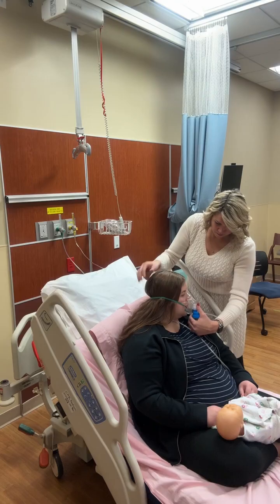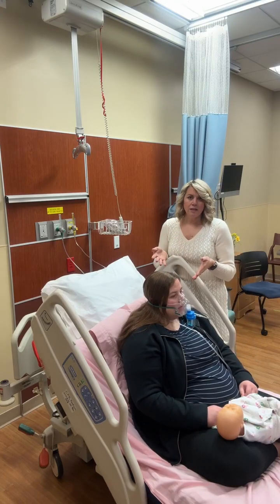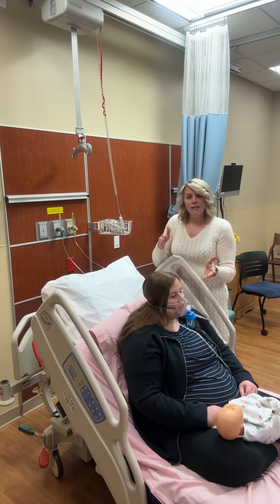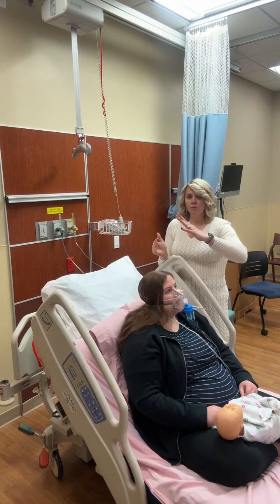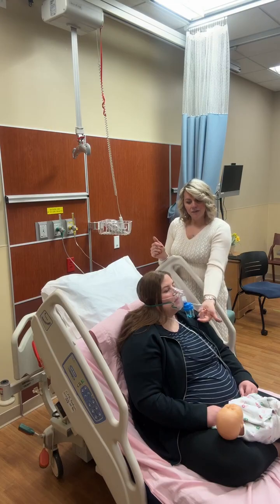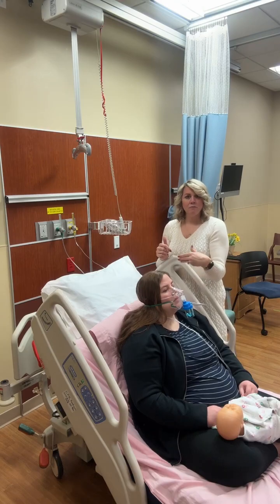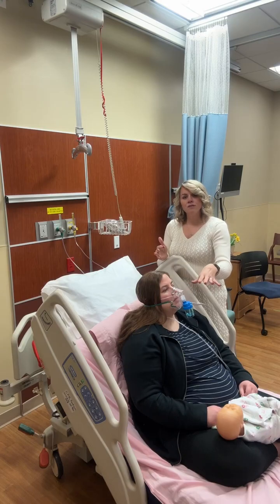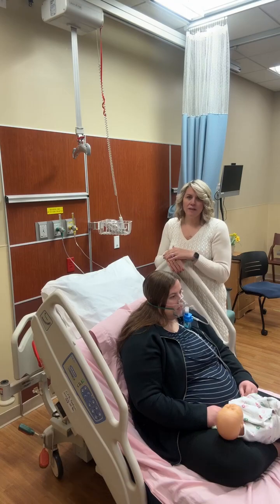All right. So she's wearing the mask and it's on just perfect. It's at a 90-degree angle. If she was to lay back in her bed, the nebulizer may go like this. And we don't want it to do that because then the air can't hit the fluid because the fluid has moved, which means then you won't see any mist coming out. So if your patient lays down or if this moves, you may have to adjust their position so that they can get all of the med. Again, we'll talk about that at the end of the videos so you can see what that looks like.